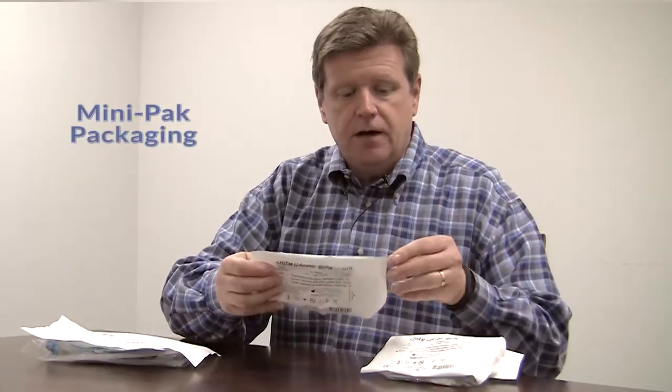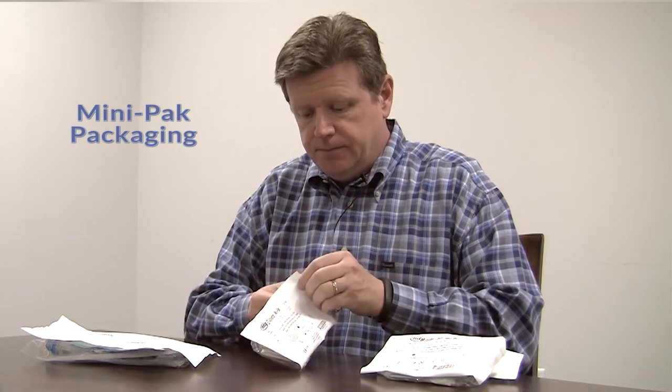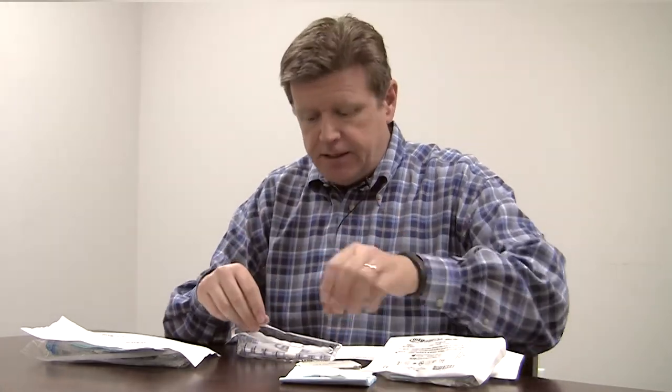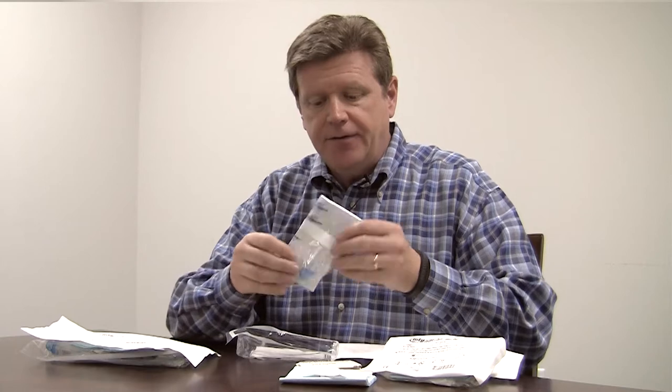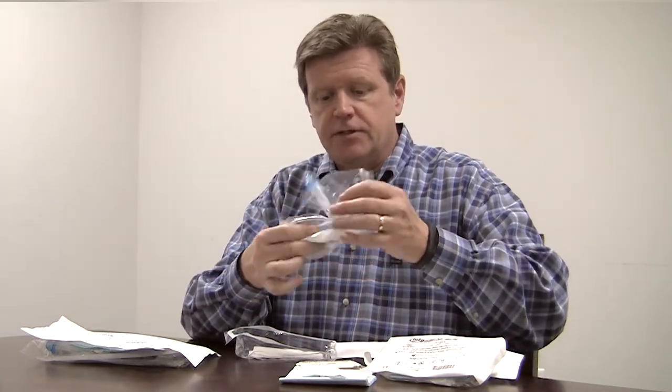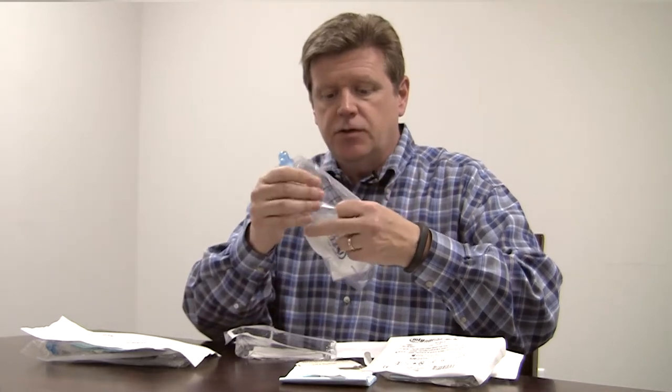The components included in our Mini-Pak version are virtually identical, with just a couple minor differences. Sterile cuff folded gloves, underpad — and you can see it's been folded to fit into the Mini-Pak — an antiseptic wipe as opposed to the swab sticks, but this does work just as well. We do have a gauze pad in there to clean up afterwards, and this is the catheter. You'll notice that even though it's folded, it's virtually the same size as the one I showed a second ago.